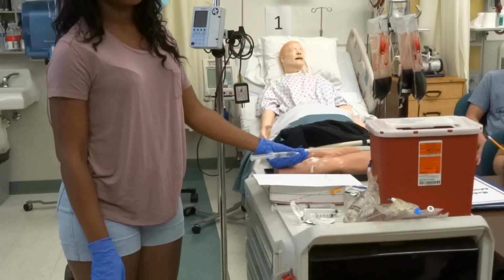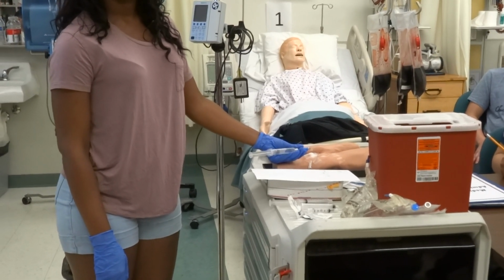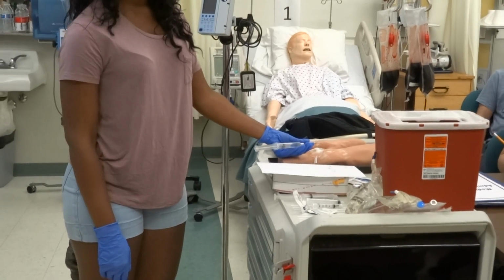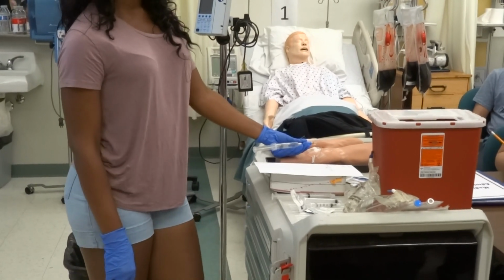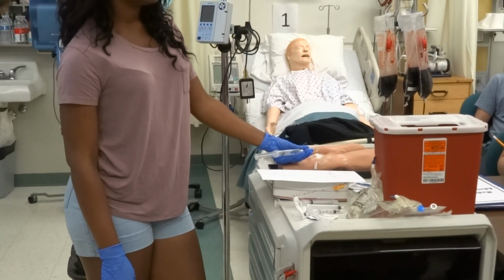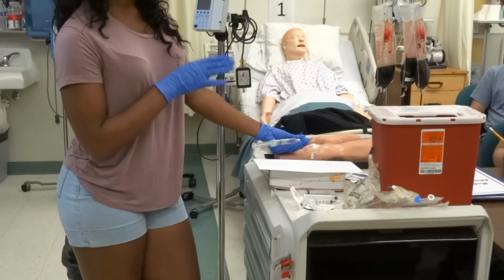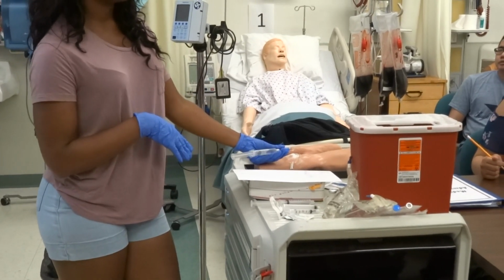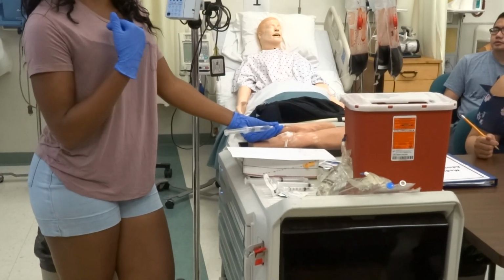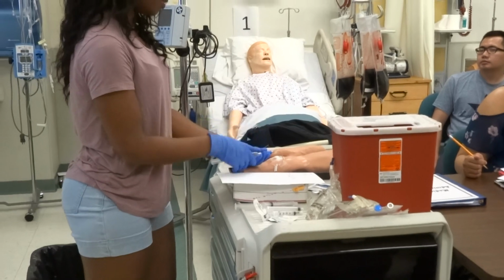We're talking about before or after you administer the medication. Before, if you're checking, there's no medication yet. For a central line, it's a little different. I don't really know if you're checking placement for that, but more so for a peripheral. But after you're done pushing the medication and you want to flush everything down, it's always 10 mL so that you make sure all the medication in the central line is going to the heart. Peripheral, it's okay to do 5.